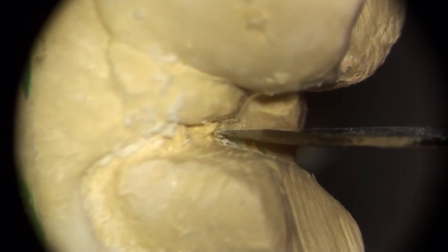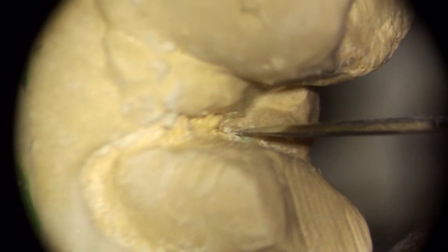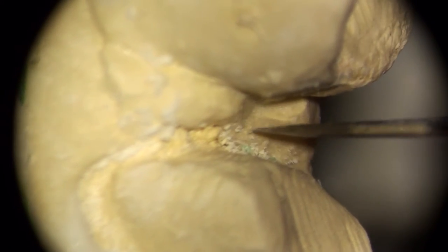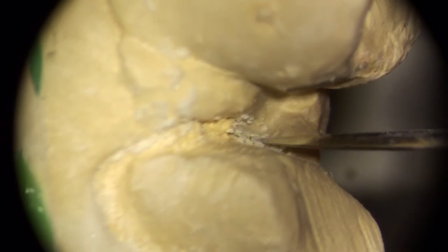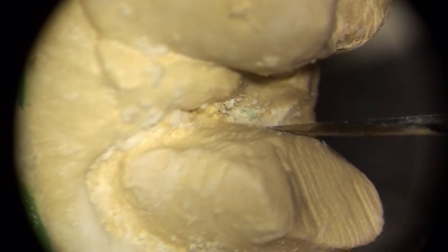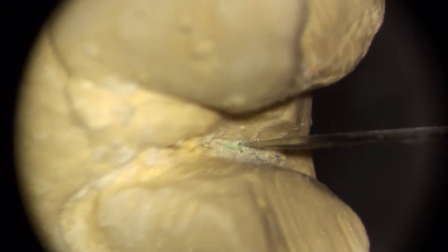So we're going to have to use this same kind of technique most of the way around. Kind of sneak in from the outside, and find some impression material in a tiny little focus. Just kind of hunt our way around here. So I won't film the whole thing because this one's going to take a long time and you'll die of boredom. But that's kind of how that technique sort of works. You're going to sneak your way in there.